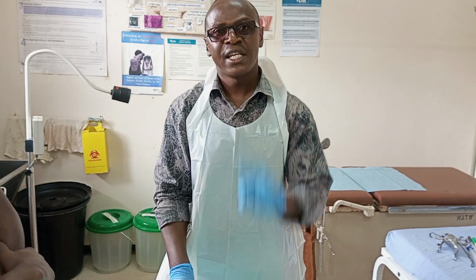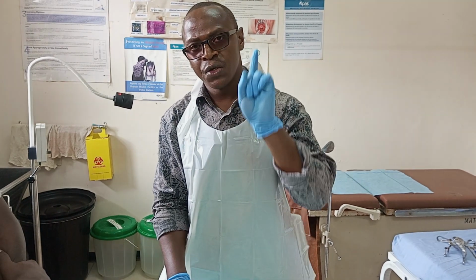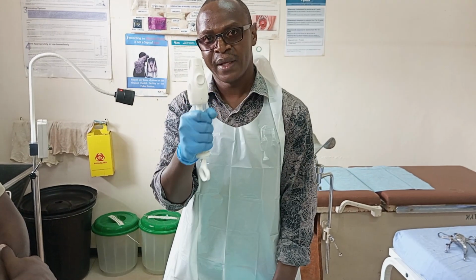All the symptoms of pregnancy disappear. So check the ultrasound scan, it actually tells you it's a missed abortion. So whatever products of conception are still developing in the uterine cavity, you can aspirate them using this one.